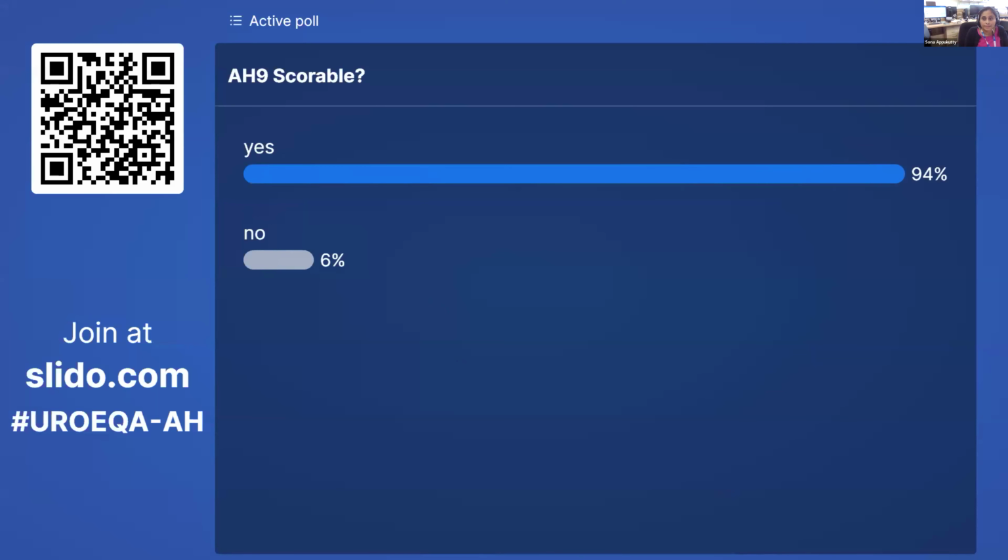All right. So most of us think it's scoreable. So should we start some scoring?